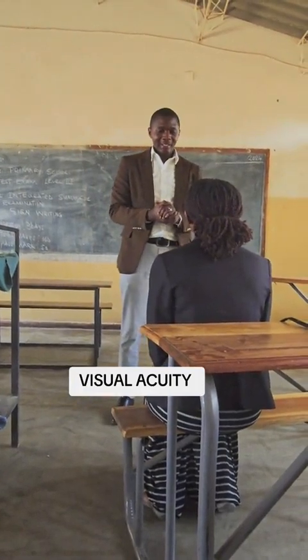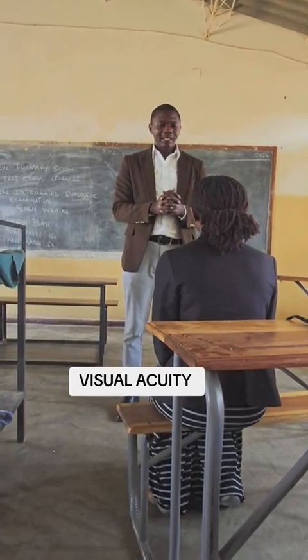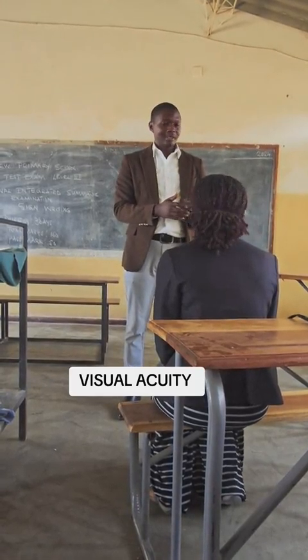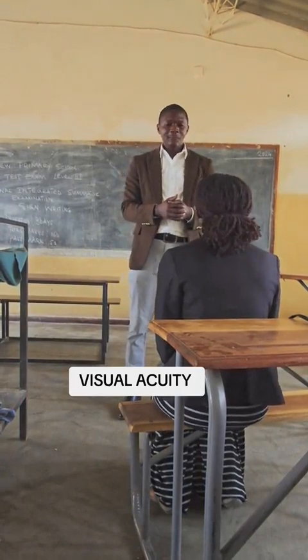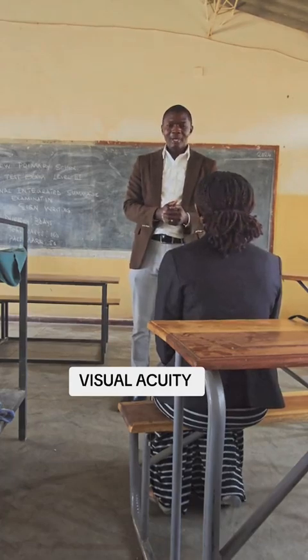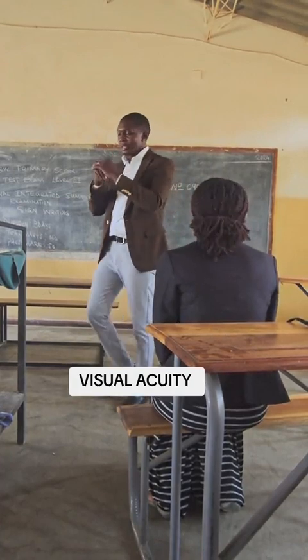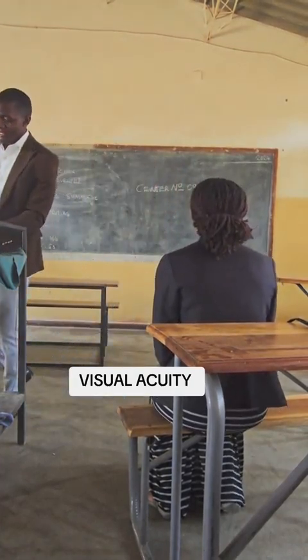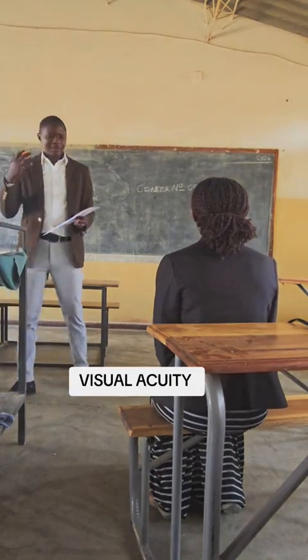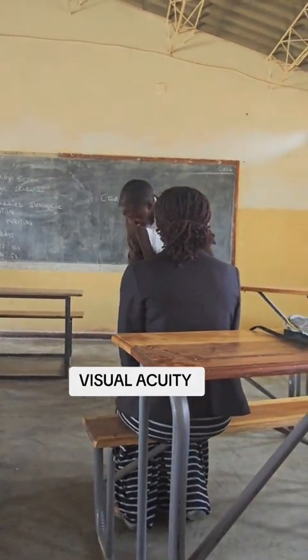Good afternoon, Miss X. I'm licensure candidate number 2841. I've been assigned to assess your eyesight using the Snellen chart. Can I go ahead? Anything I can do for you around here before I proceed? Thank you. I'll be back to do the procedure. Once you get permission, again you sanitize, and you pick a plain paper, and of course you have your pen, and then you sit with the client.